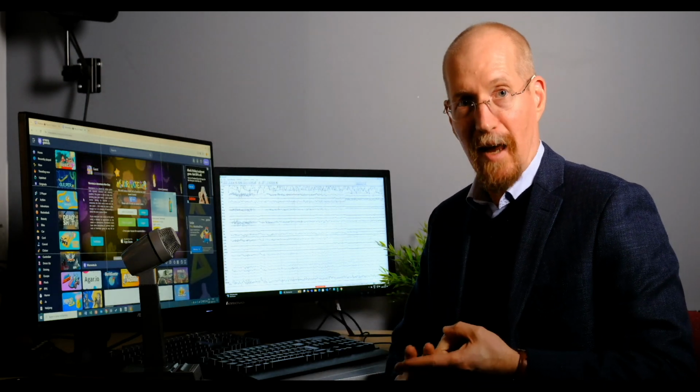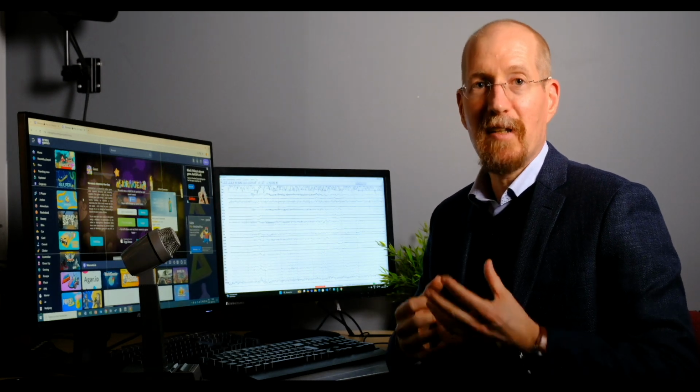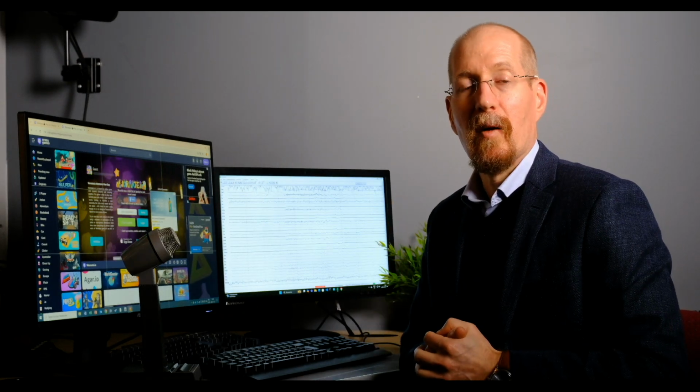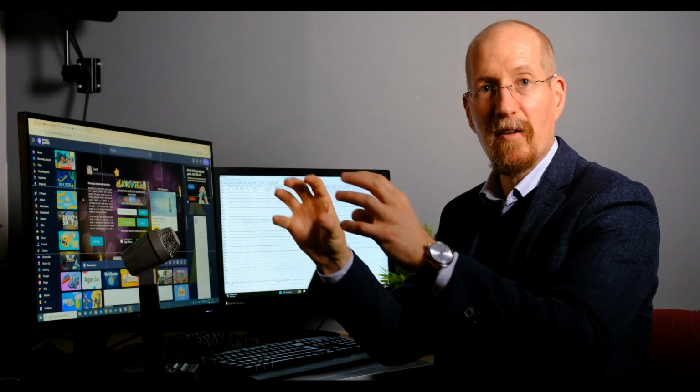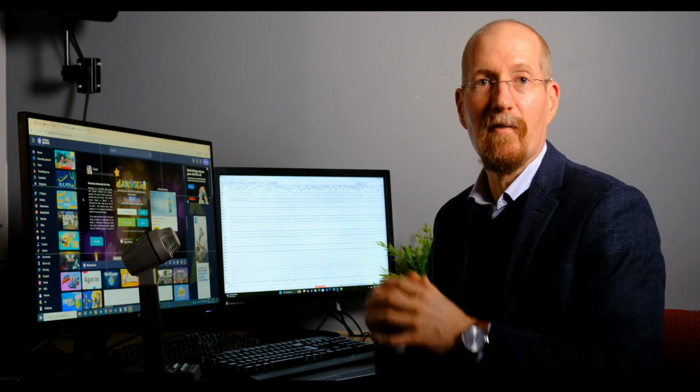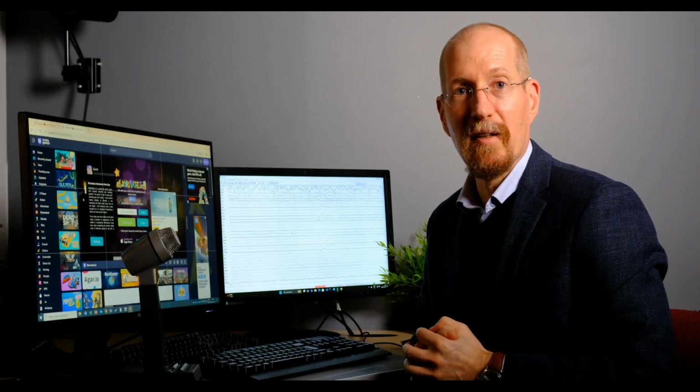The second task that we'll run is much more difficult. It's a multitasking task. The participant will have to control various different objects simultaneously on the screen and keep them in a state of equilibrium. As you'll see later when we start the task, it starts out simple but gradually increases in complexity.